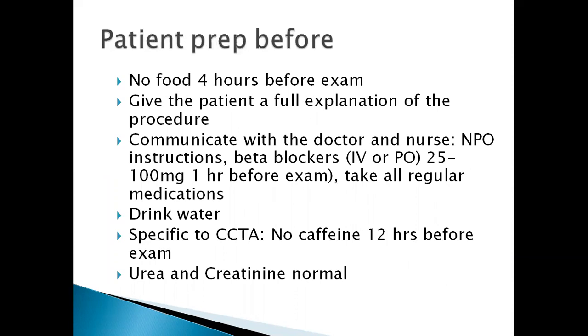So when you are booking the patient, you need to now explain the full procedure. I don't know why specifically, but patients who come for CCTA mostly come very scared. So you have to give the patient a full explanation and make sure that they understand every aspect of your instructions. And then you tell them, just like any other contrast media examination, that they shouldn't take any food 4 to 6 hours before the examination. They must just drink enough water and hydrate their bodies.